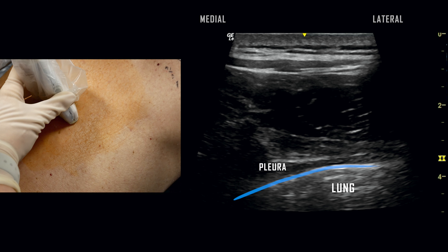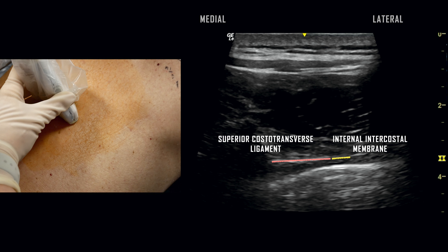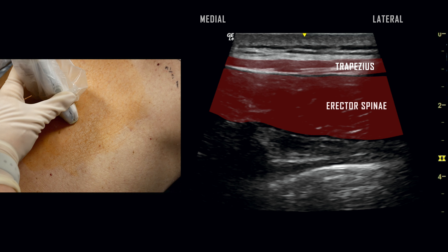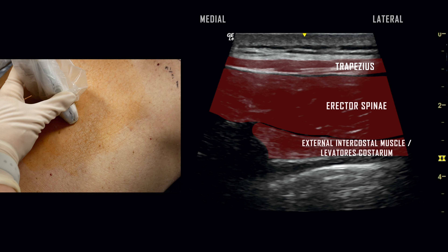Parietal pleura together with the innermost intercostal membrane are seen as a bright hyperechoic line. Both the superior costotransverse ligament and contiguous internal intercostal membrane are seen here as well. The muscular structures include the trapezius, erector spinae, and external intercostal muscle with levatoris costarum.